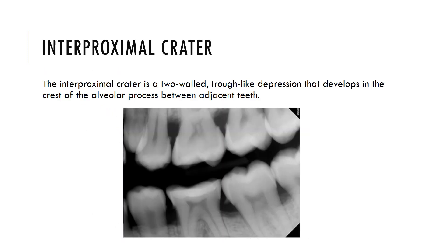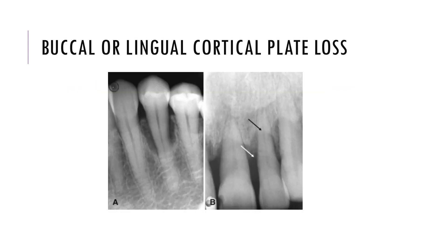An interdental crater is a two-walled trough-like depression that develops in the crest of the alveolar process between adjacent teeth, as seen here with the second molar. Buccal or lingual cortical plate loss can be difficult to assess radiographically as it is hard to determine which plate is buccal and which is lingual, and it must be complemented with intraoral examination. This difficulty is due to superimposition of the buccal and lingual cortical plates.